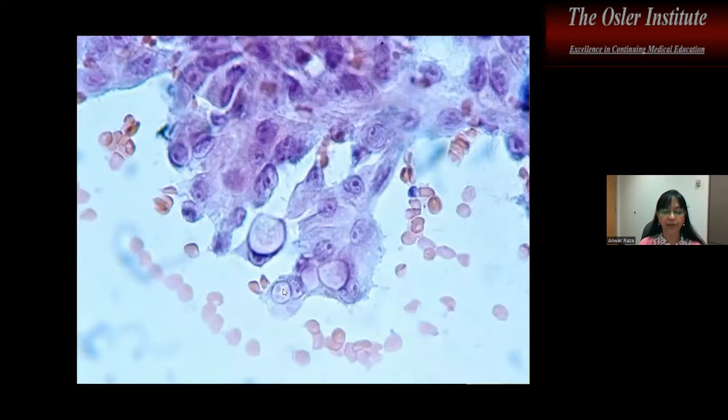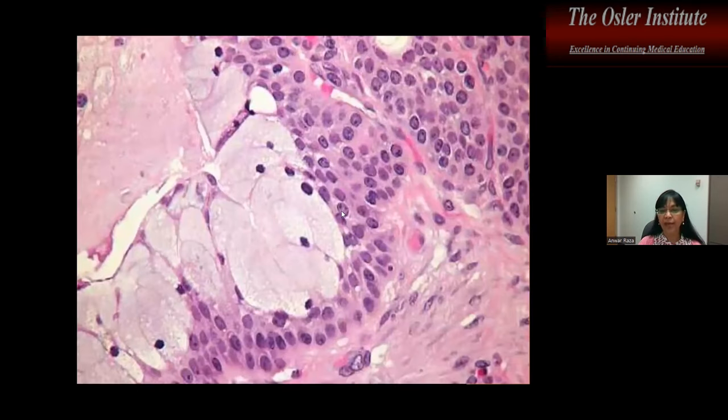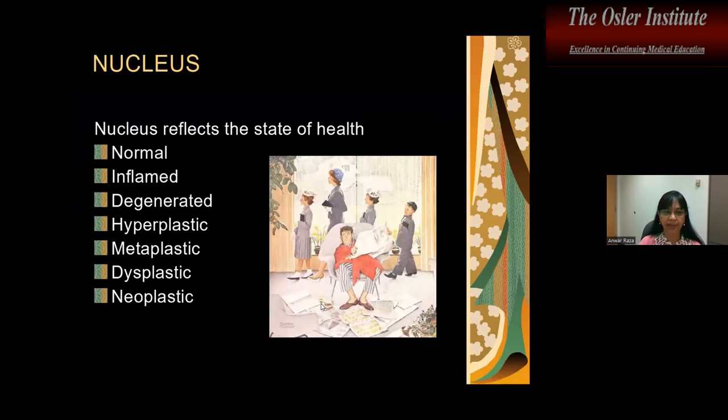So pleomorphic adenoma. Salivary gland, again, you see some cells with cytoplasm with some secretion. So there's a glandular component there, and then maybe also more of an epidermoid component. So mucoepidermoid carcinoma. So you can see more than one cell type in that.